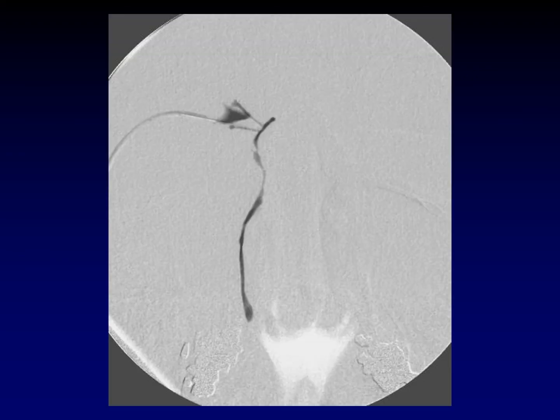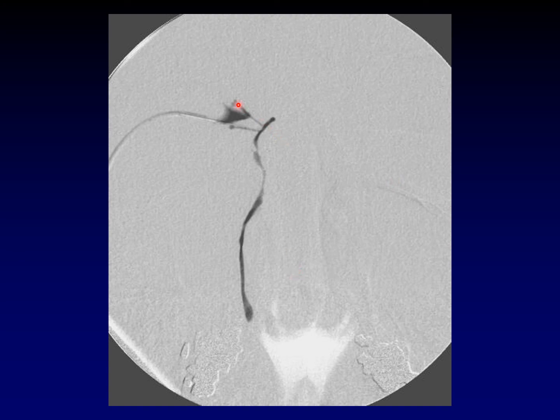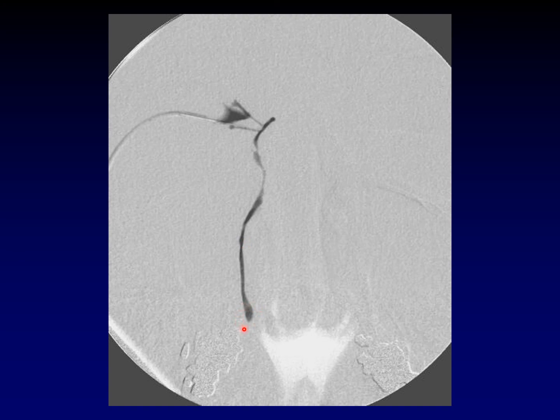This is a normal frontal projection dacryocystogram. You can see the system has been cannulated with a 27-gauge Rabinov catheter through the inferior puncta. There is a superior and inferior puncta on the upper and lower lids of the eye, and you can see a draining canaliculus — a superior and inferior canaliculus extending medially. These often combine into a common canaliculus, then dump into the nasolacrimal sac, from which material drains down through the nasolacrimal duct and empties into the nasal cavity at the inferior meatus.